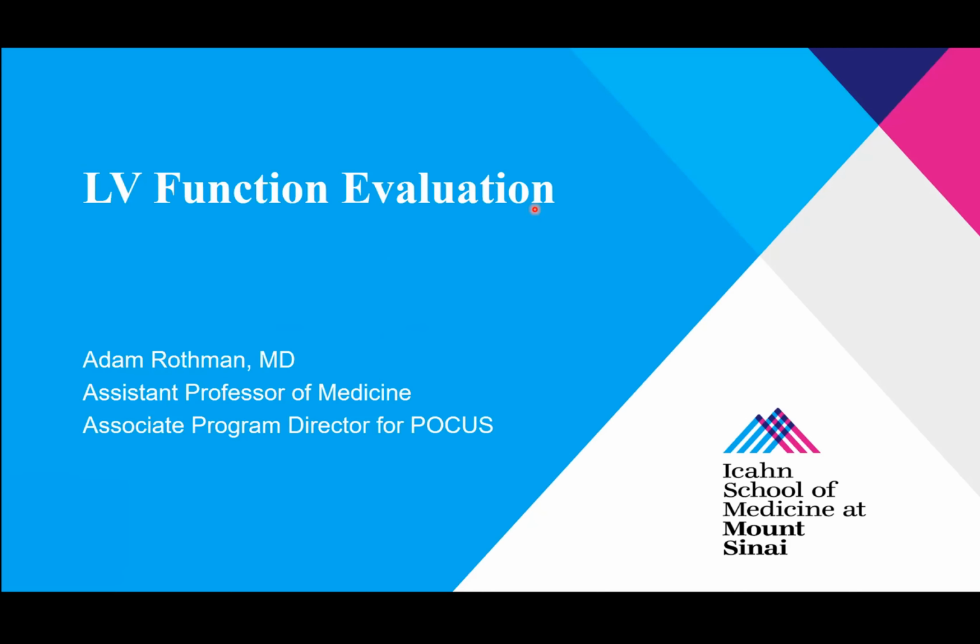Obviously we've given you guys talks on the basics of POCUS during one of the prior academic half days. And for most of you who went through the sim lab in cycle 2, you got at least the basics of lung ultrasound. So now we wanted to break down one of the most important aspects of point-of-care ultrasound, which is assessing LV function at the bedside.